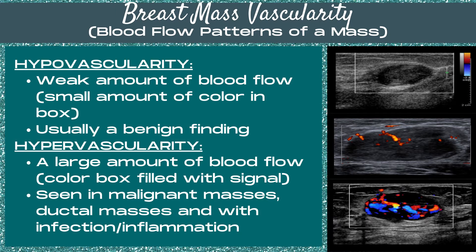Then there's hypervascularity. This is where there's a large amount of blood flow and the color box is filled with color Doppler signal. Hypervascularity is seen in malignant masses, ductal masses, and also with infection or inflammation in the breast.